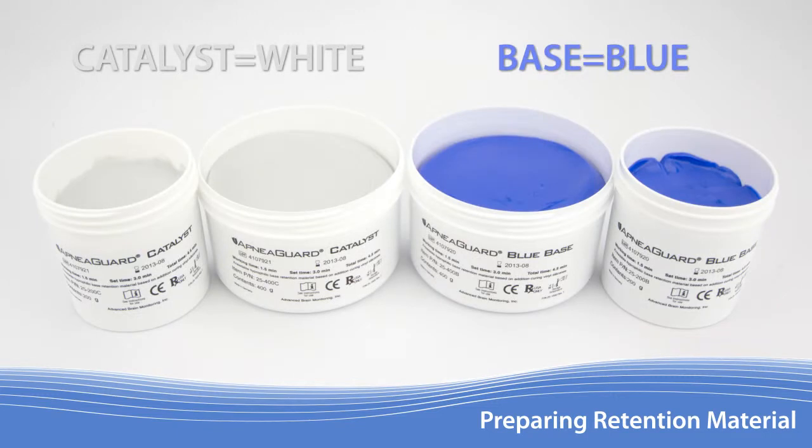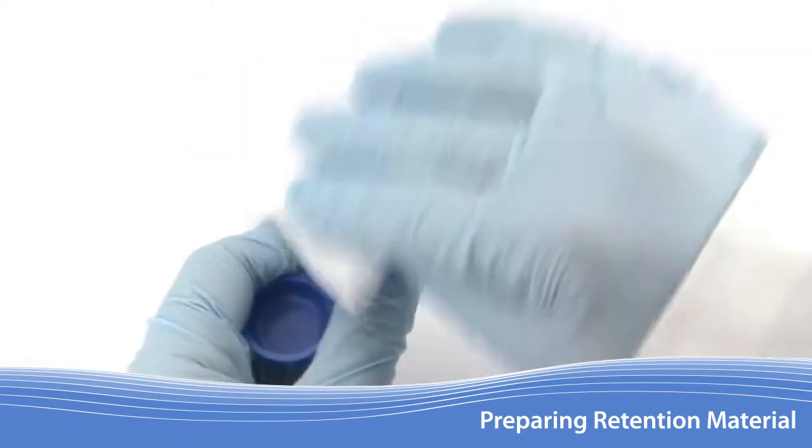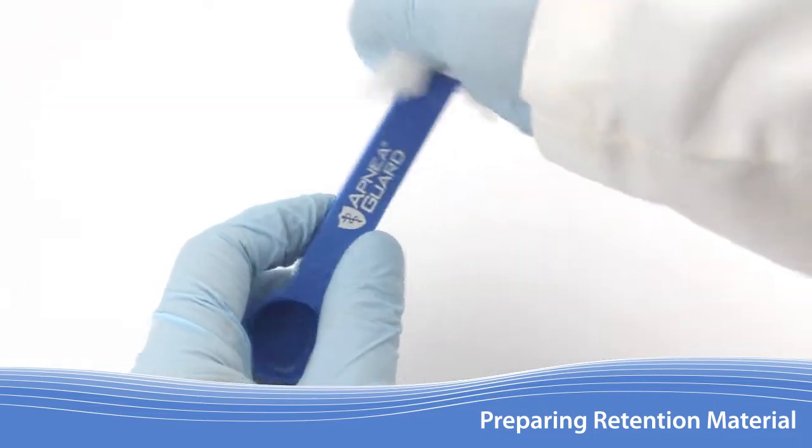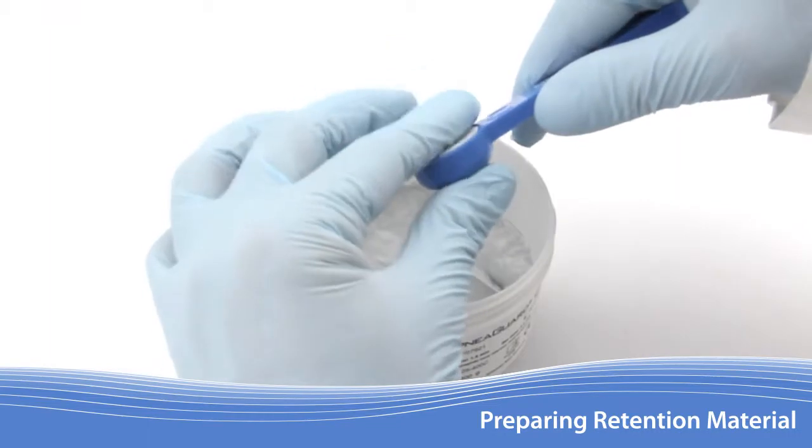The Apnea Guard retention material requires equal parts of a blue base and a white catalyst which are mixed together. The amount of each material is carefully controlled with a custom sized scoop included in the Apnea Guard kit. Each side of the scoop is labeled with either a C for catalyst or a B for base. Make sure to use the appropriate side of the scoop for each material type to avoid activating the contents of the tub. The scoop should be thoroughly cleaned with an alcohol wipe prior to each use.